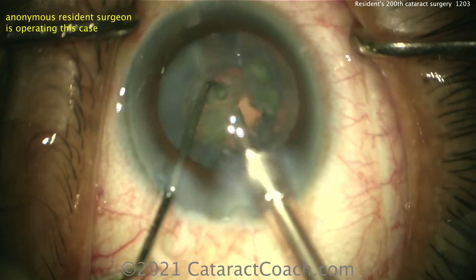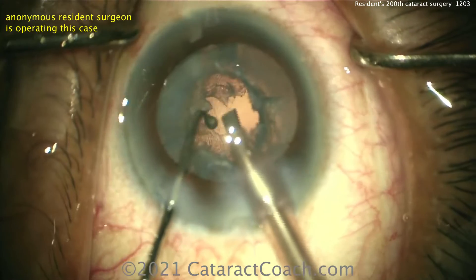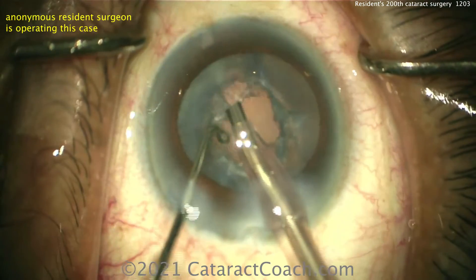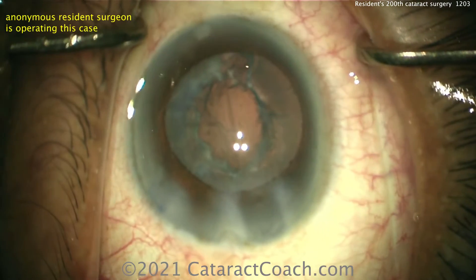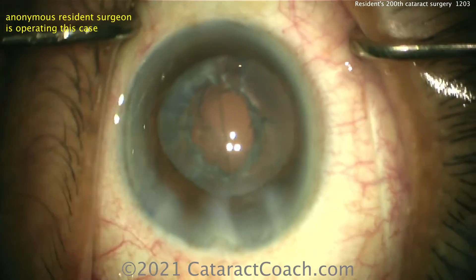Very nicely done taking that last piece down — there it goes, excellent. Now there's an epinuclear shell. Let's see if you can get that with the phaco probe — nice and gentle, barely giving vacuum, no energy. And if you can't, don't worry, use the IA probe. Better to be safe. Looking good, looking really good.